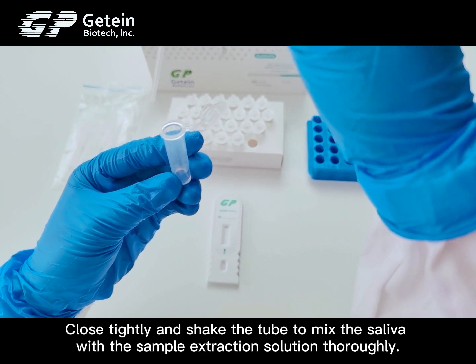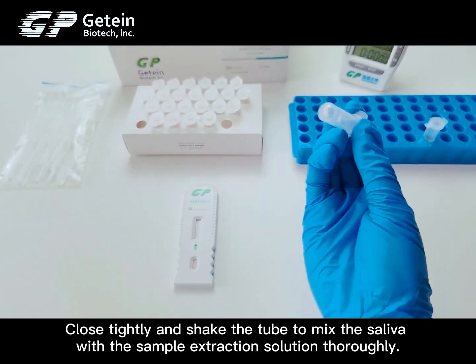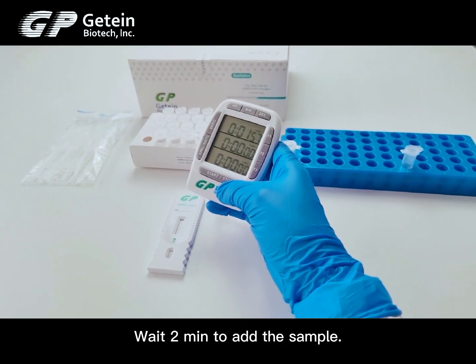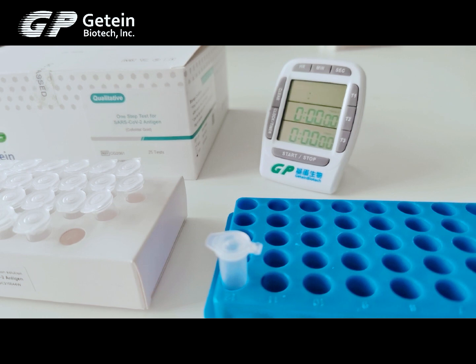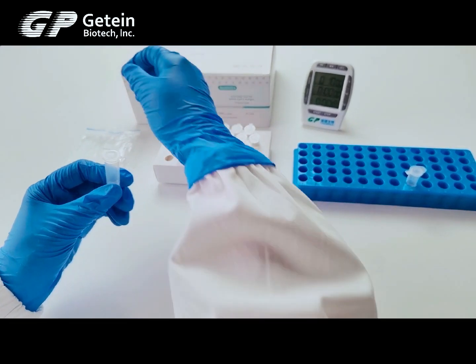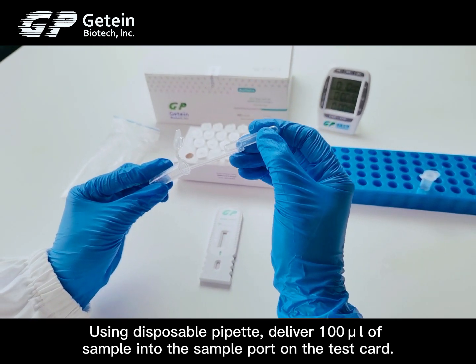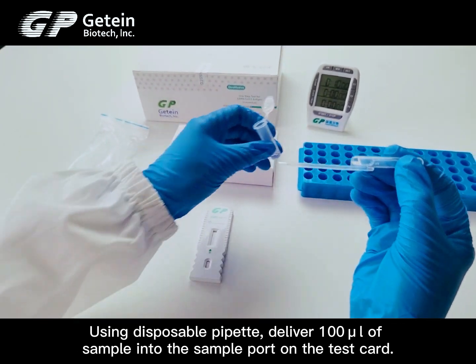Close tightly and shake the tube to mix the saliva with the sample extraction solution thoroughly. Wait 2 minutes, then add the sample to the sample port.